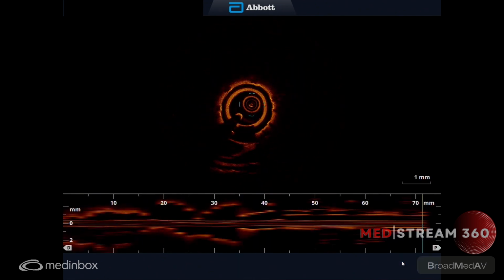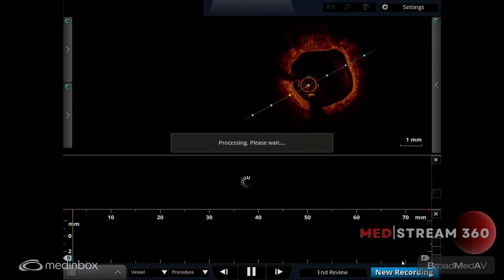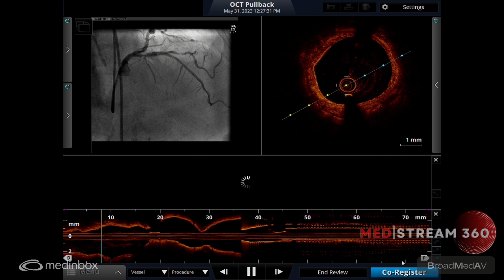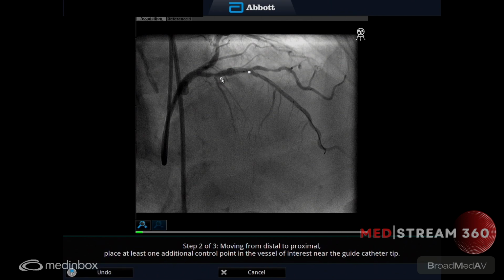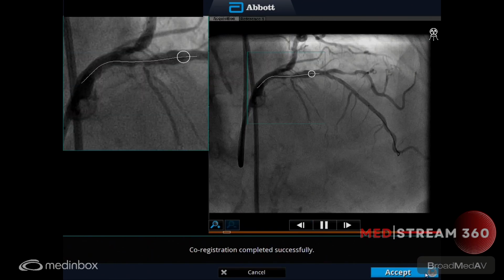Beautiful. All right. We'll walk this guy out while I go register. We got a good picture there. Got to come out with this. Make sure we're doing all good, right? Let's go register this thing. There we go. I'll give you the OCT here. I hope I didn't take that last line. Let's see what we see here.